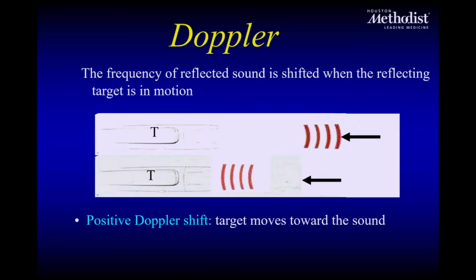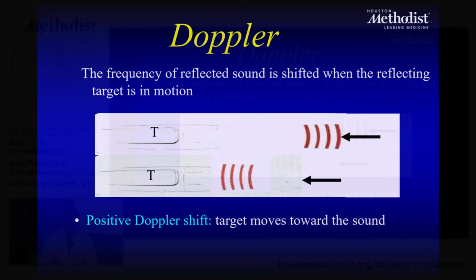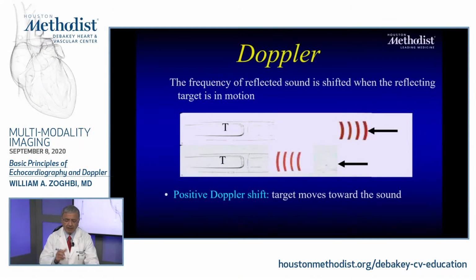The best example we usually take is a siren: you're standing on the street, and the ambulance comes over, and you could tell if you close your eyes that indeed that ambulance is coming towards you, because the pitch goes higher. And you could tell even that it is going away from you because the frequency will come down.